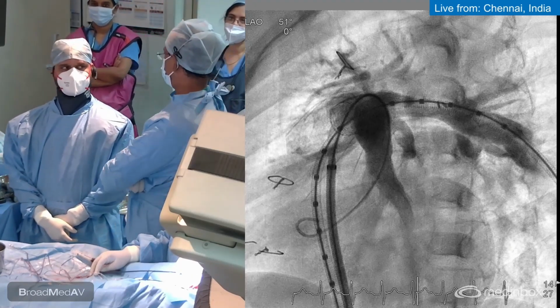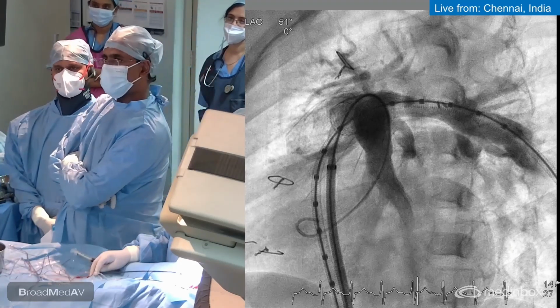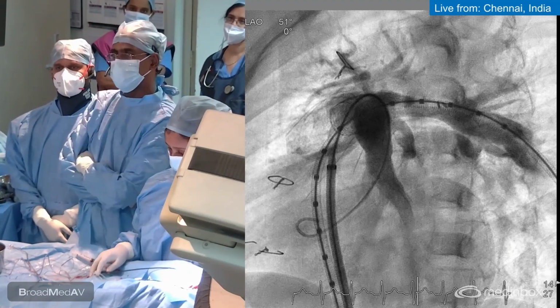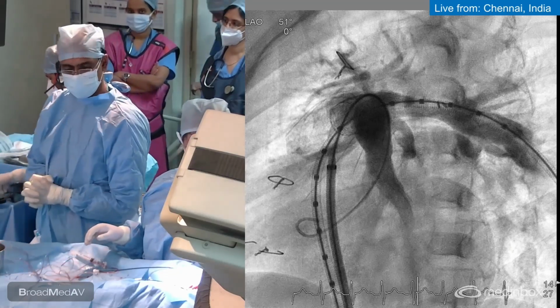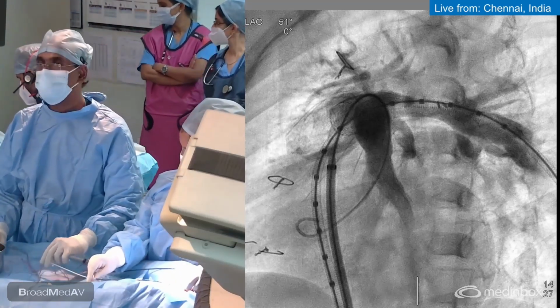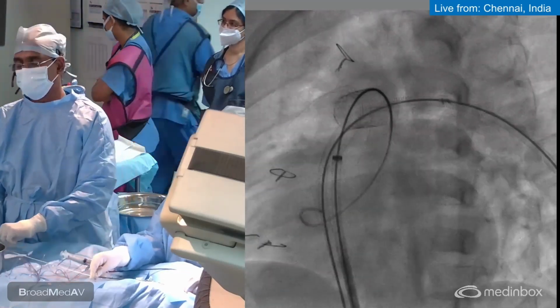In fact, you observed in your CT that the left pulmonary artery was a little bit tighter, smaller. So let's start with the 8 into 30 formula on the left, and then progressively keep enlarging it larger and larger. So we are going to be taking an 8 into 30. I'll take out this marker pigtail that we have introduced into the sheath.